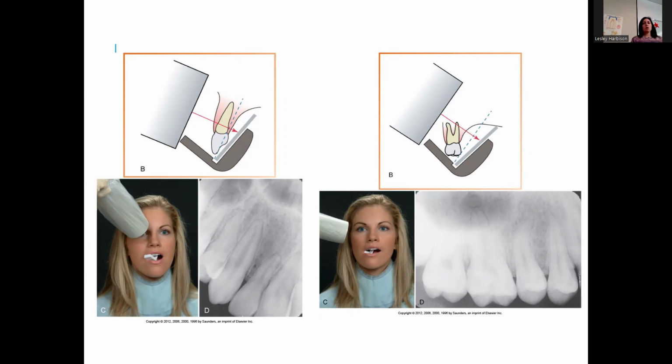So there's always distortion, and you may see more or less depending on the angulation, the patient's mouth, like there's lots of variables, but that's common. And if you're doing bisecting the angle, you're likely to see more distortion just in general in that area.